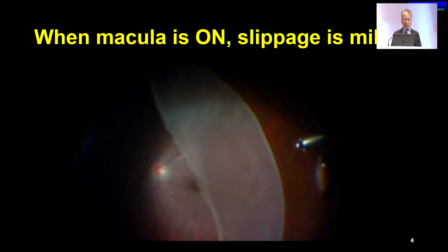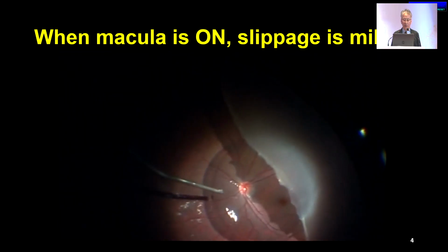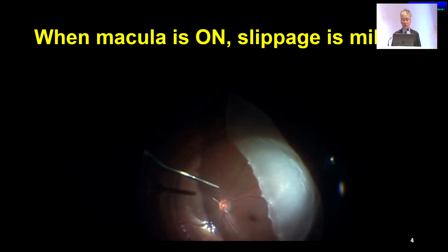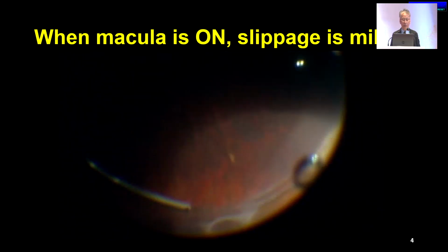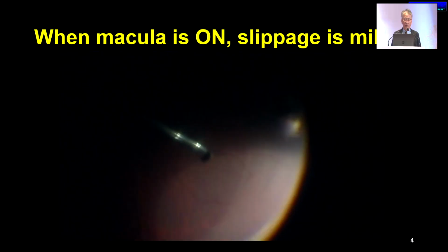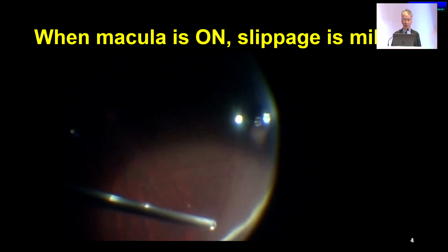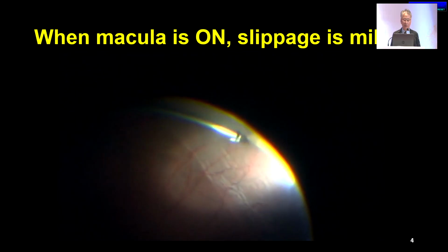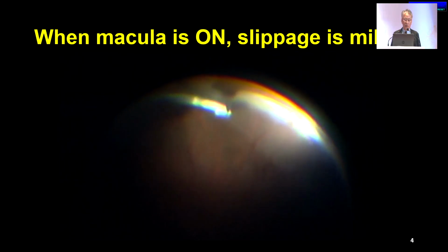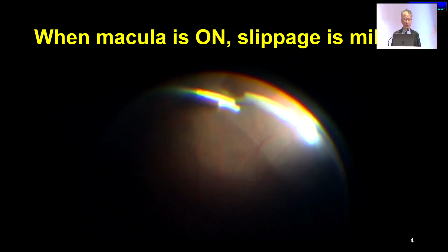So when the macula is on and the slippage is mild, what should we do? In this case, you can see that when we open up this retina, there's some grayish shadow at the side posterior to the retinal break. And this area actually has some intraretinal contraction, like a PVR change. So I made some radial cuts for these patients.